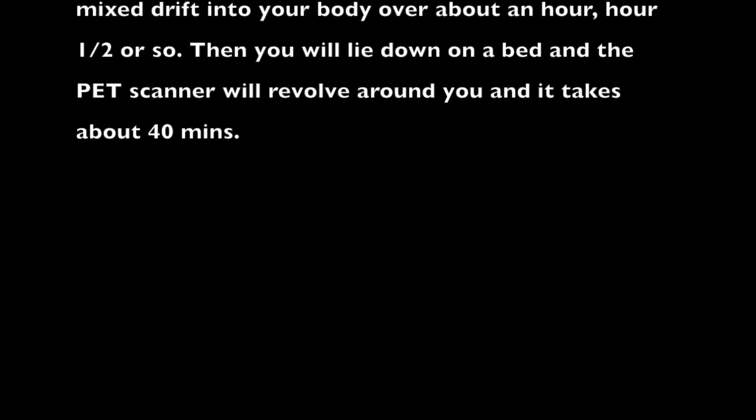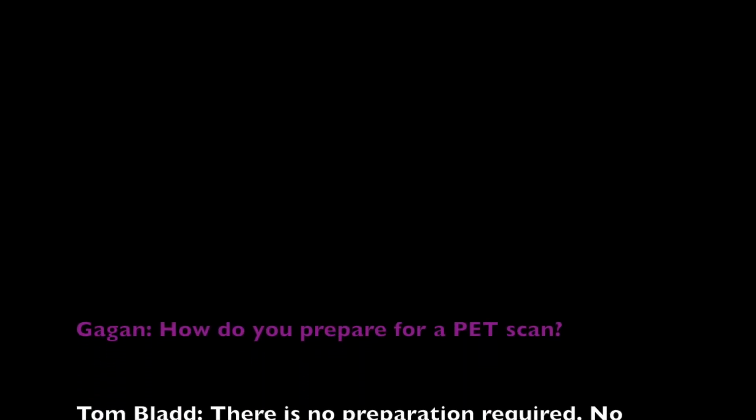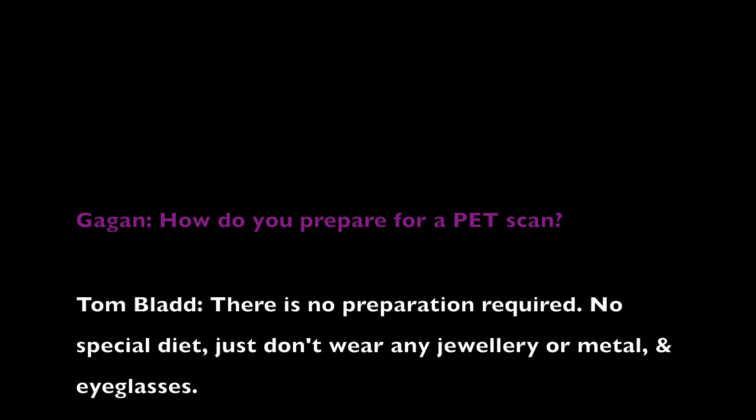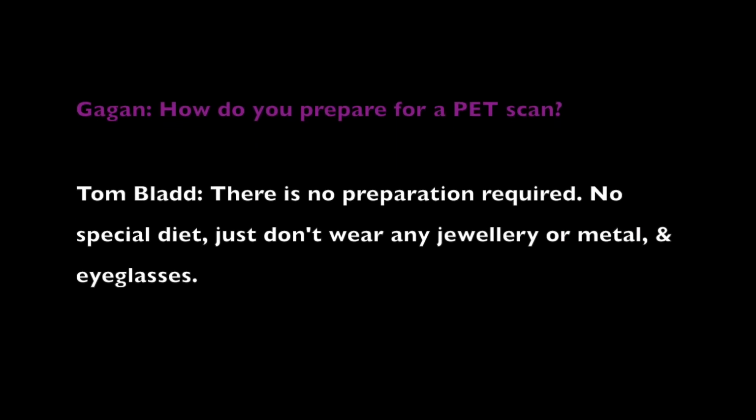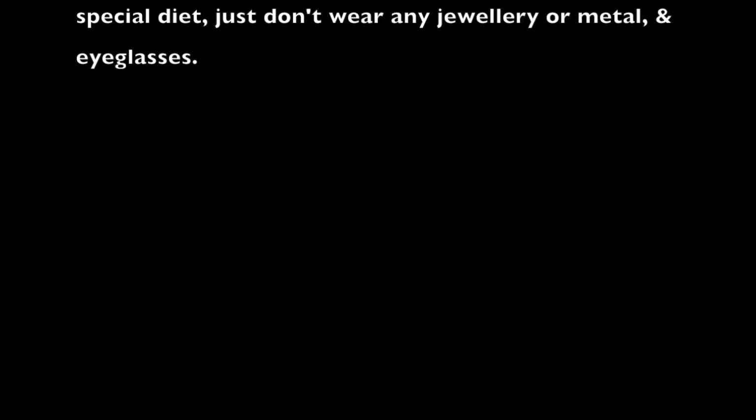The PET scanner will revolve around you, and it takes about 40 minutes. There's no preparation required, no special diet. Don't wear any jewelry, metal, or eyeglasses.